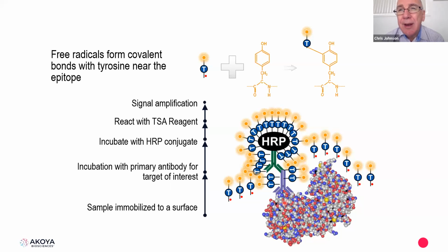Also, it depends a little bit on where you place it as well. Now, as I saw in the slide, if I use Ki-67 as an example, it tends to be more productive if it's left towards the end of the cycles rather than the beginning, whereas if you use CD20, for instance, it needs to be towards the beginning rather than the end.